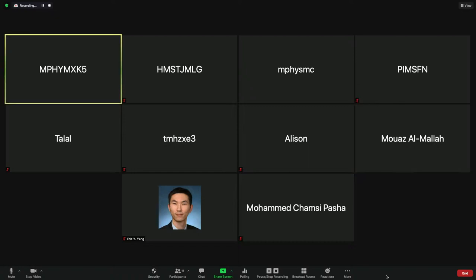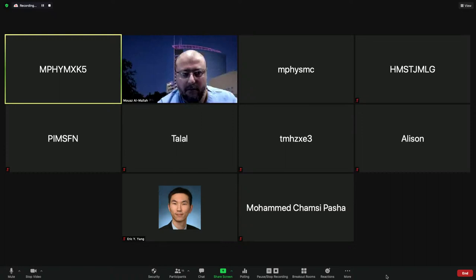And on the management spectrum, I want to add that when patients have extensive LVAD infection, where basically the entire LVAD is infected, the PET scan really helps us. Where the extent of the infection is very severe, we do consider full exchanges in our institution from one device to another, for instance from HeartMate 3 to HeartMate 3, which we've done, or from an HVAD to HeartMate 3. That is how seriously some of the infections are taken, because whenever people have infection, particularly with Pseudomonas or Candida, because of these recurrent infections they're at risk of catastrophic intracranial bleeds and strokes. So it does change our management for sure, and serial PET scans, which have been a new kid on our block, have been really helpful in clinical management.